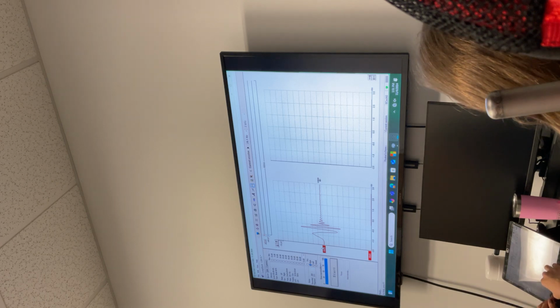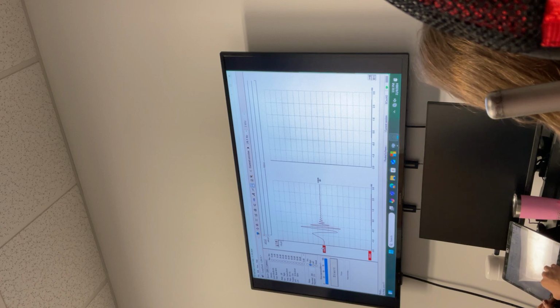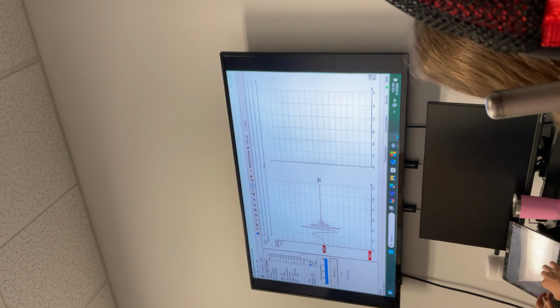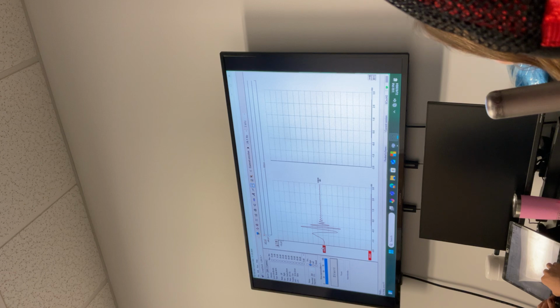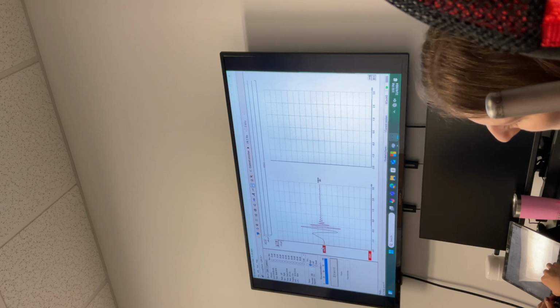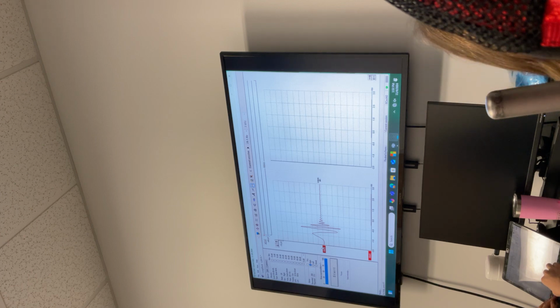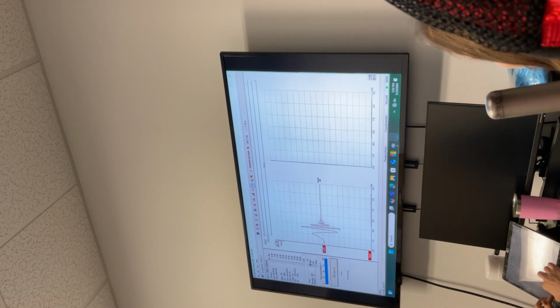So with the chirp, they have adjusted the 0 point for averaging so that the latency of the chirp stimulus matches that of the click. They delay. Like the 0 point is shifted. The 0 point is not the onset of the sound. It shifted to a different time.